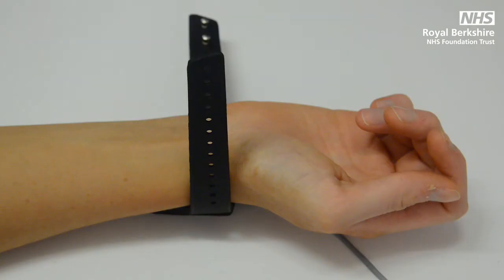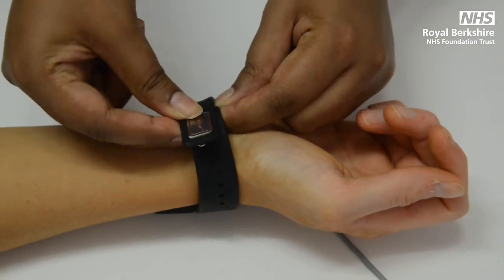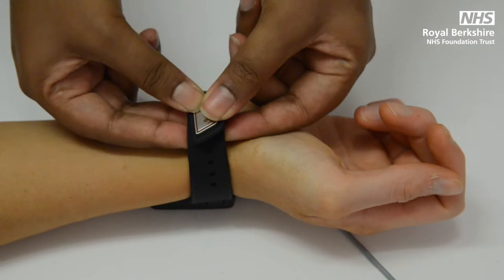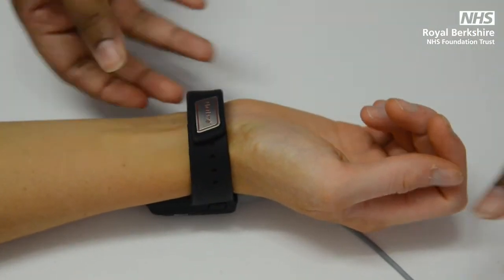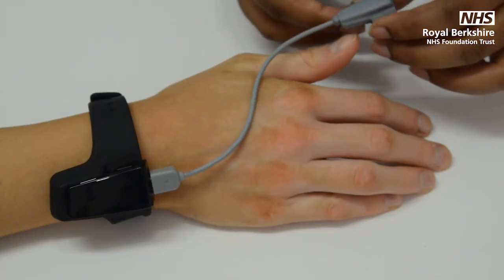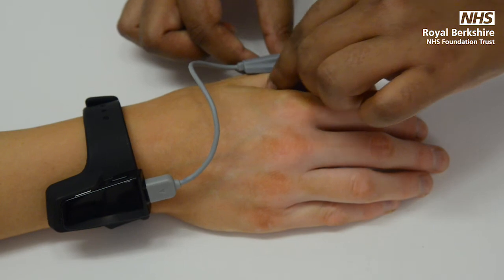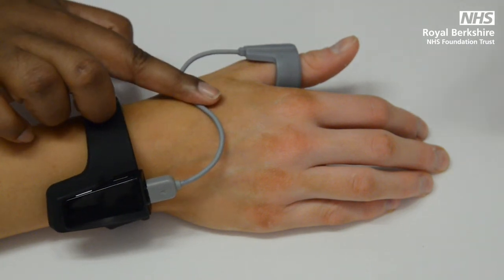For this machine, place the strap around your wrist on your non-dominant hand, ensuring the studs go through the holes to secure it. You will have either a thumb probe or a finger probe to use. If you have the thumb probe, place the probe at the base of your thumb with the wire going over the hand. If you have the finger probe, place this on your middle finger, ensuring the wire is going over the hand and that you are not wearing any nail varnish or false nails.